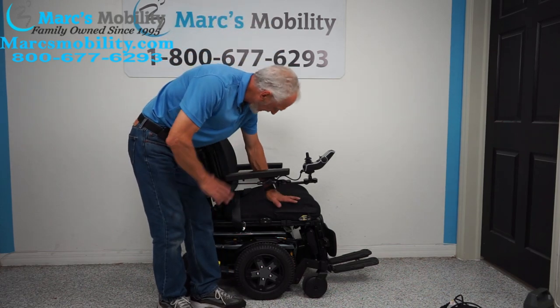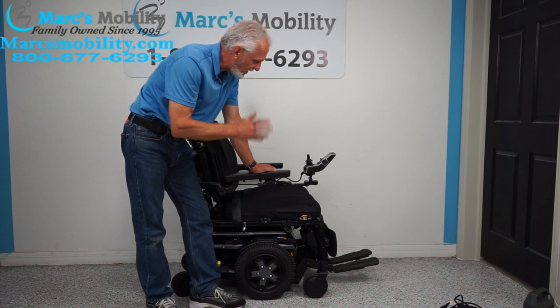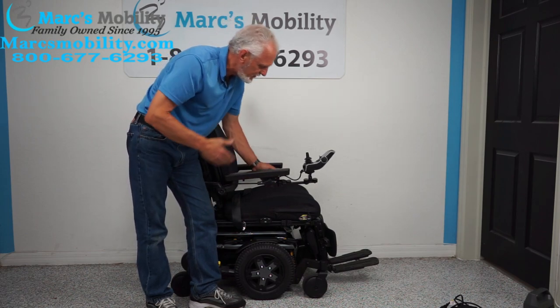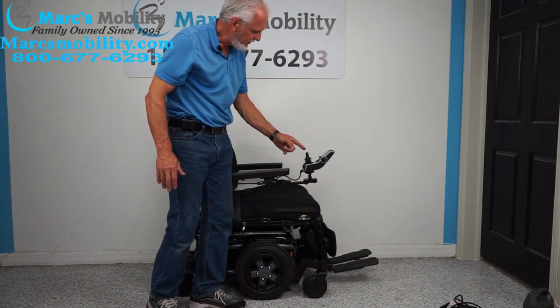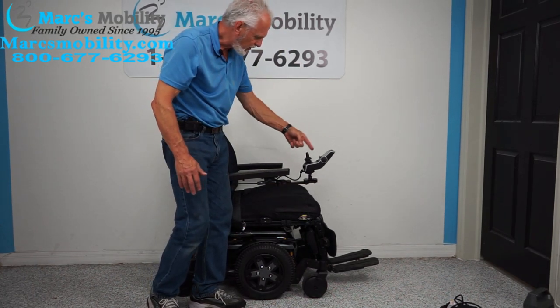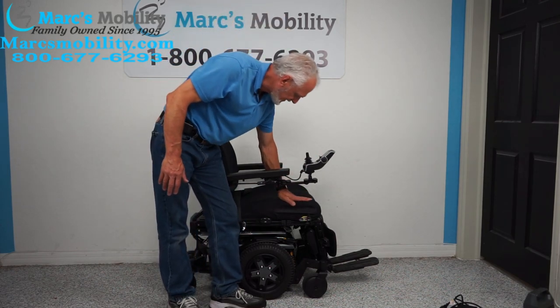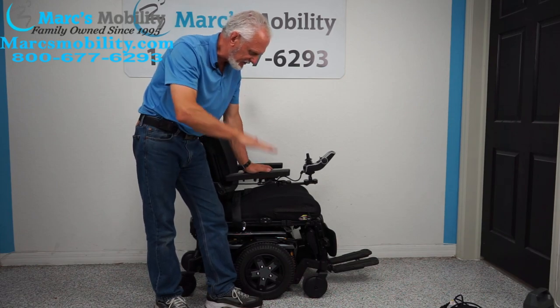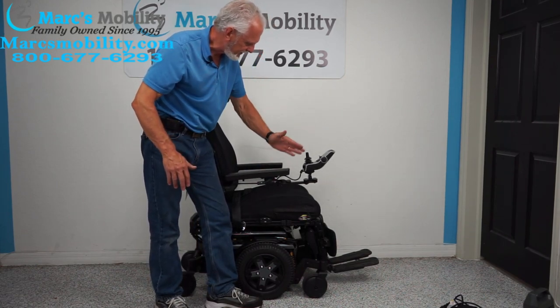Whatever portion is yellow on the screen is the function available through the joystick. Right now I want to start with the seat lift, so I want only the base — the cushion — to be yellow. By moving the joystick sideways, you can change the colors on your seat display to select different functions.